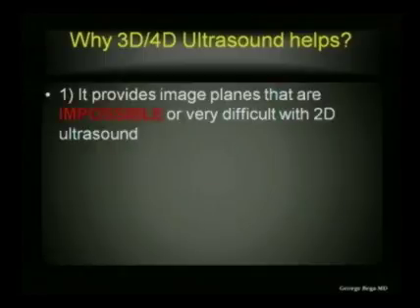Number one reason why 3D ultrasound helps is this one. It provides for us image planes that are simply impossible or very difficult with 2D ultrasound. This is the real big one. This is the big reason why we need to use 3D ultrasound.